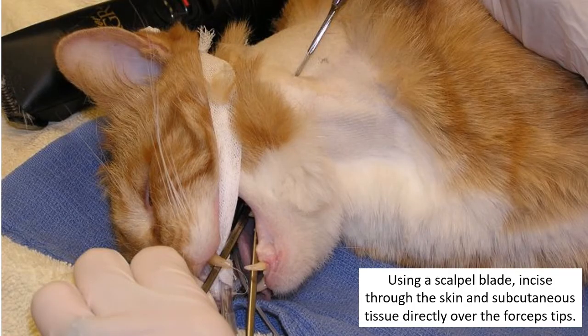Using a scalpel blade, incise through the skin and subcutaneous tissue directly over the bulge made by the forceps tips. Make sure the clamps are closed and remain closed until the tips protrude out through the skin incision. The esophageal wall can be caught and torn if the box locks of the forceps are open and the tips separate before the tips penetrate the skin.